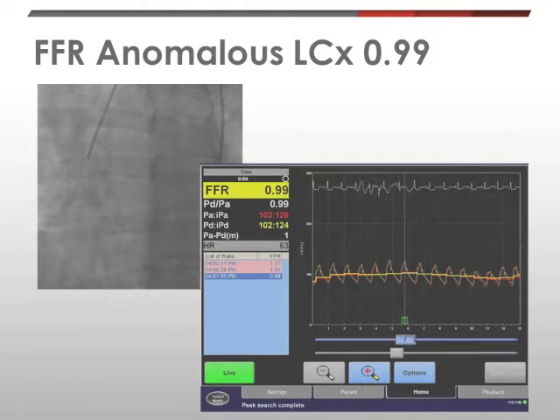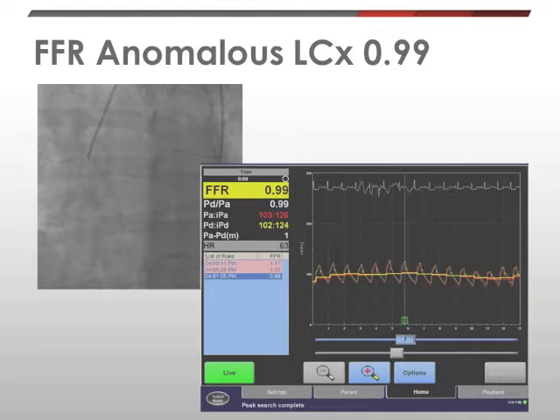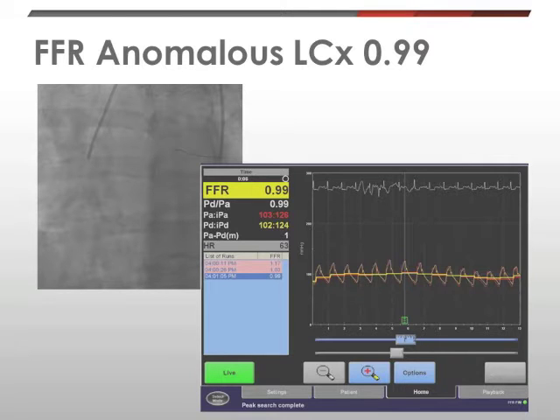I elected to perform fractional flow reserve testing of the proximal and mid-circumflex lesions with a pressure wire and using IV adenosine. As you can see here, the FFR was measured at 0.99, demonstrating these lesions not to be hemodynamically significant.